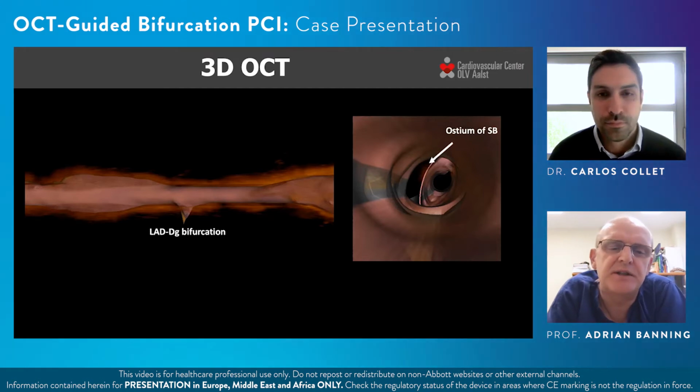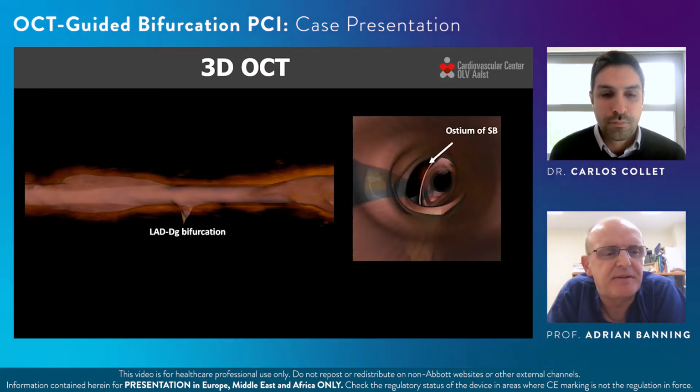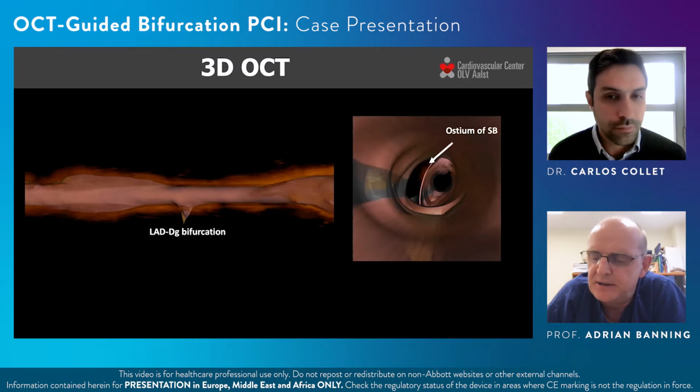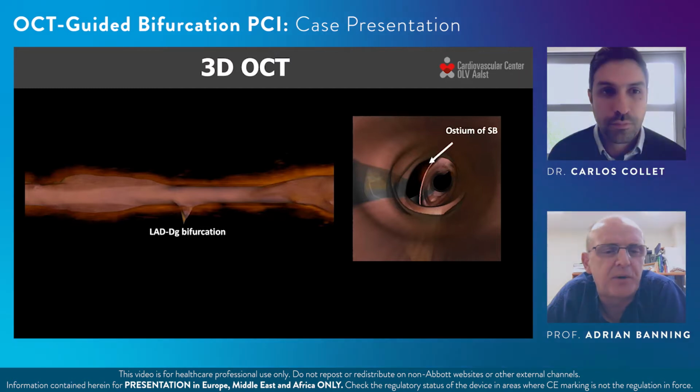Drug-eluting balloon versus a second stent. Clearly, because this is, I guess in this case, a third stent, because this is a bifurcation, we've all put 2 more stents inside 2 existing stents. But it can be difficult, particularly maintaining wire access to the branches. Which technique would you favor? Would you prefer to try and treat this with a drug-eluting balloon if at all possible?